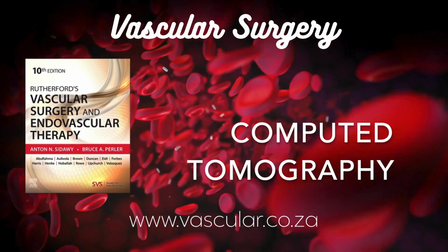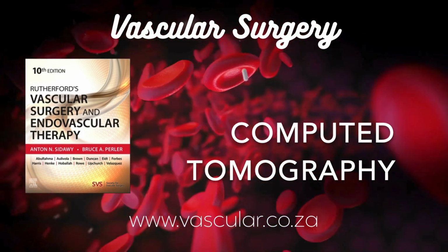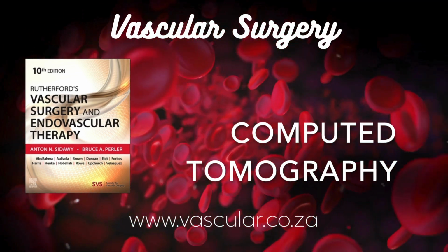PET/CT combines the metabolic info from PET with the anatomy from CT. Big in cancer, but finding vascular roles too, looking for inflammation in infected grafts, vasculitis, or unstable atherosclerotic plaque. There's a whole chapter on that too.